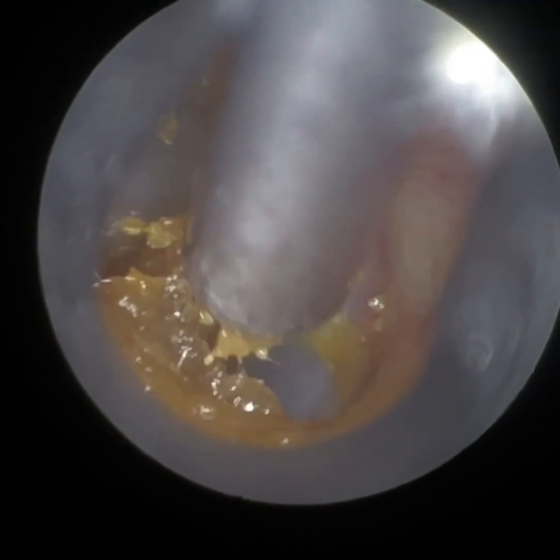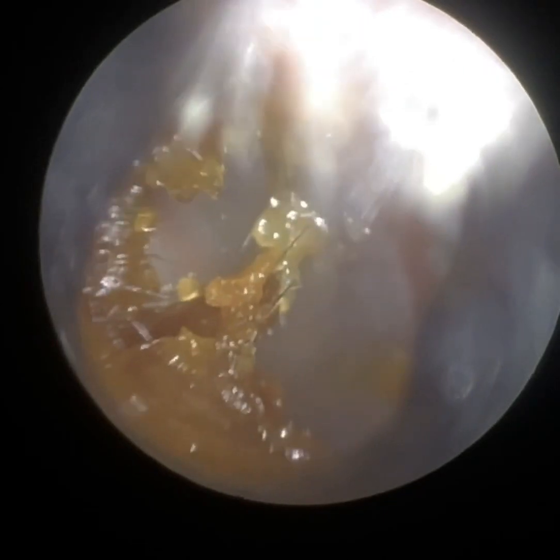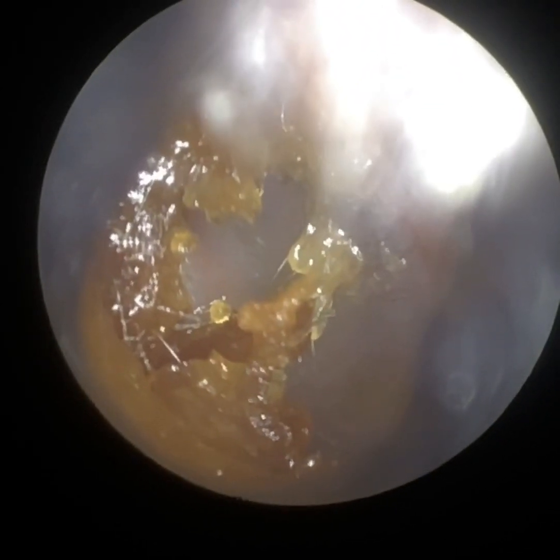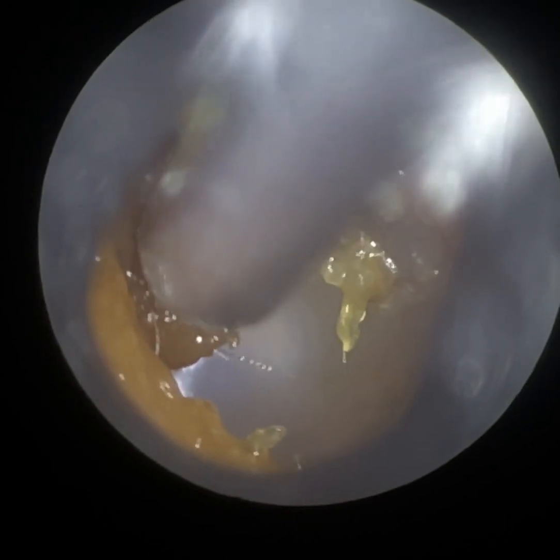There's a little base and a dip near the eardrum itself. You can see the majority of the wax. We're just going to refocus and remove this residual wax that's positioned anteriorly and superiorly. The patient can hear significantly better already.